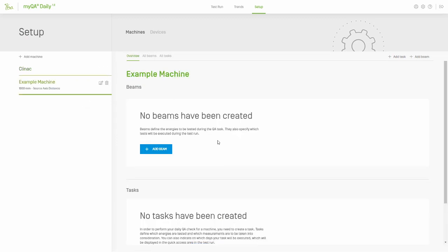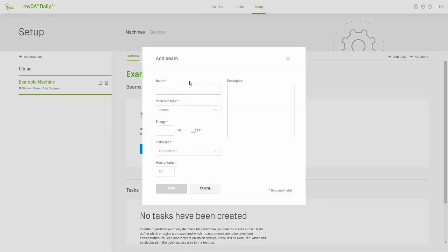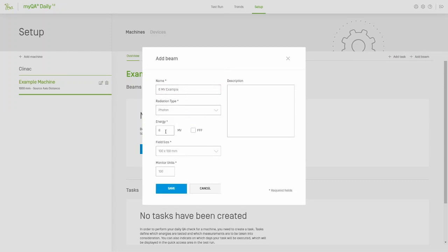Now select your new machine and click the blue Add Beam button to open the Add Beam interface. To define a new beam, you'll need to select the radiation type, energy, field size, and number of monitor units for the field. You can also define any details needed regarding that beam.